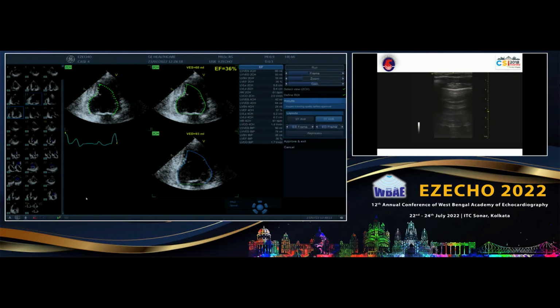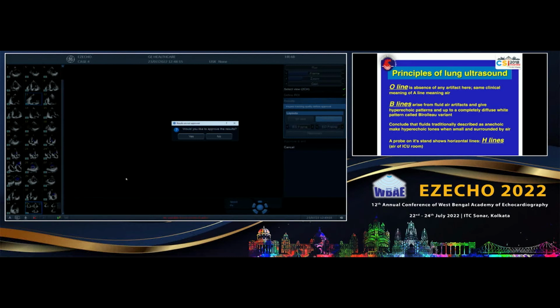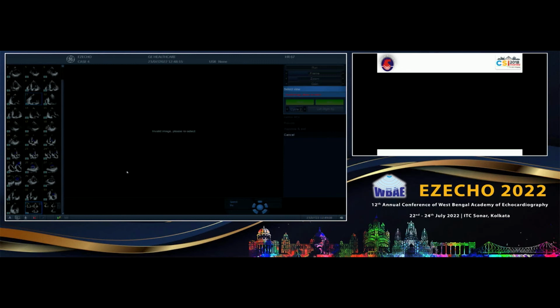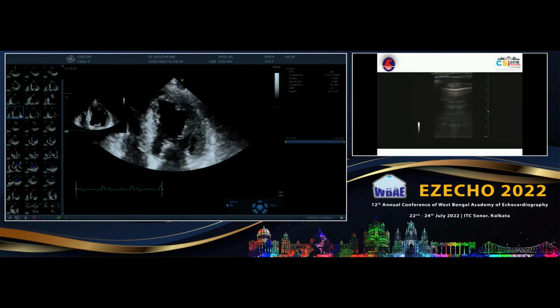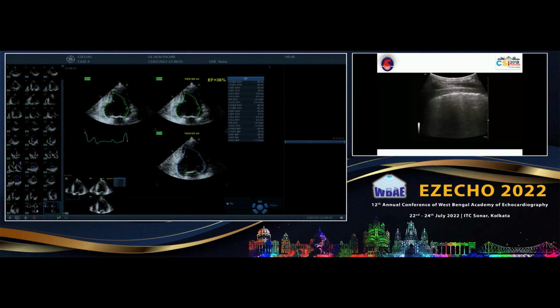The ultrasound cannot penetrate the air. So what it does is that, just a minute, just stop that, keep it there only. Just go back, because that is very interesting. I'll stop it. Yeah, so what happens is that, why is it not stopping? I don't know. Just freeze it, not the next one.